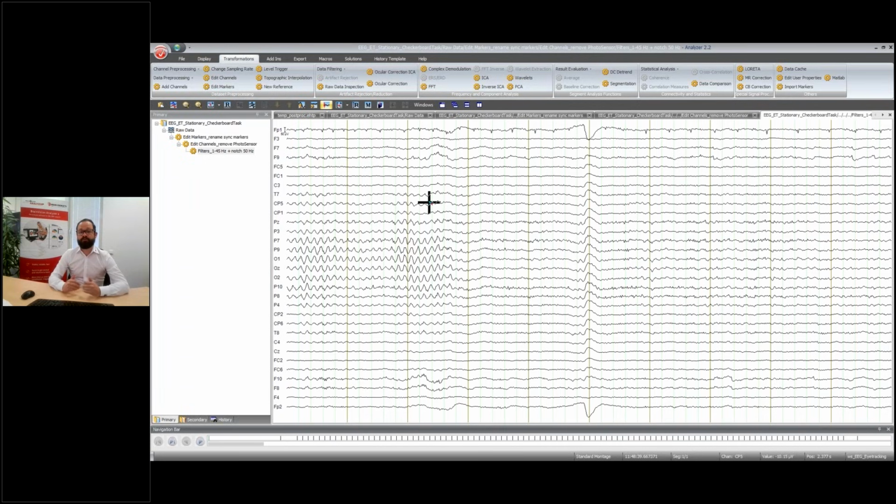So it might not really reflect what happens when the subject attends the stimulus. That's why the second pipeline would make use of only those trials where we can control with the eye tracker that the subject attended our stimulus. I want to show both types of pipelines to you.